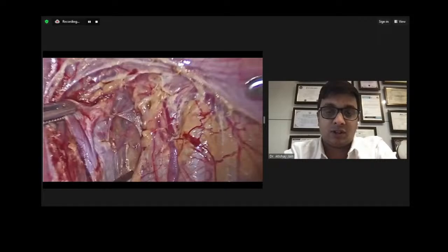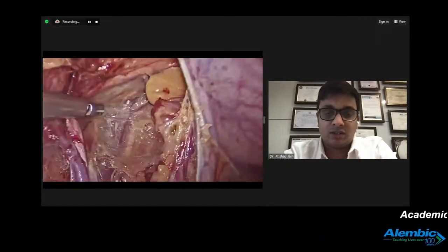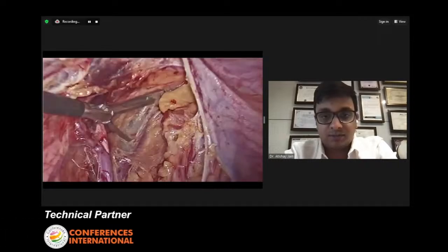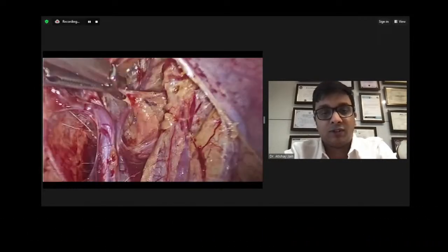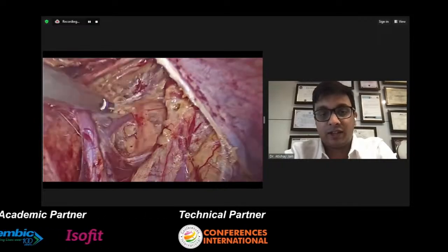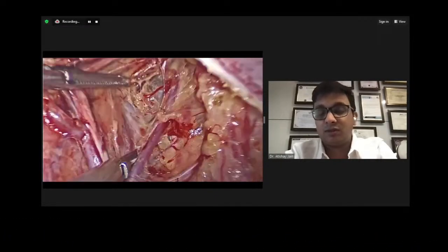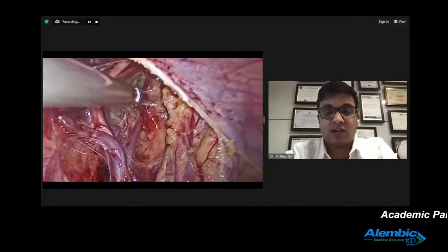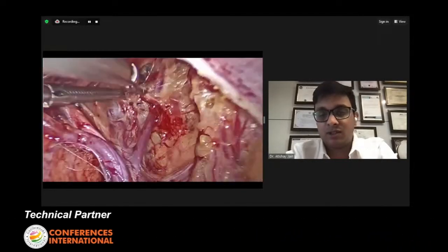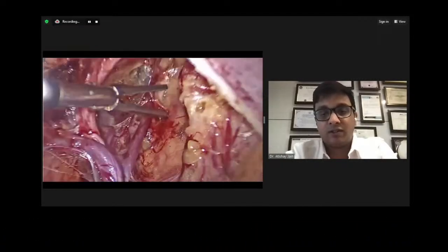This is how we can see the obturator vessel. The nerve is now clear, and the artery is clear, and the vein is below it. So in this situation, we need to be very careful, as you know, a lot of vital structures are lying there. A little amount of bleeding might lead to a lot of bleeding. The corona mortis also lies here, and laterally, as you can see, there are external iliac vessels, the artery and the vein.